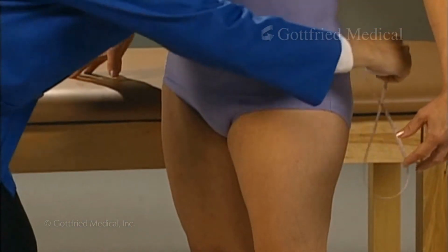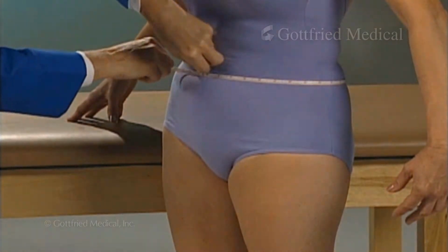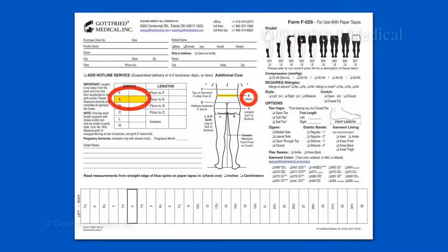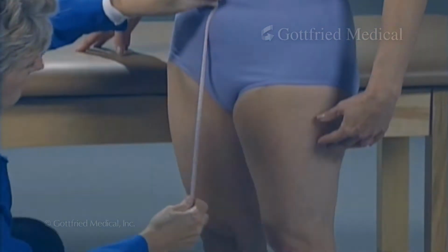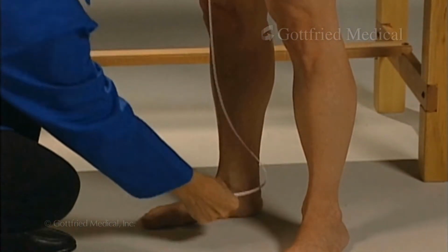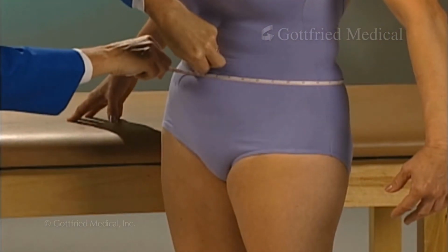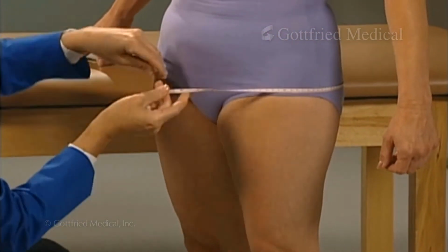With the patient or customer standing barefoot, measure the waist, or point E. On the form, record this measurement in the table beside the diagram, next to the letter E. Then measure from point E to the floor, and record it in the corresponding space in the table. Follow the same procedure at points D and C.